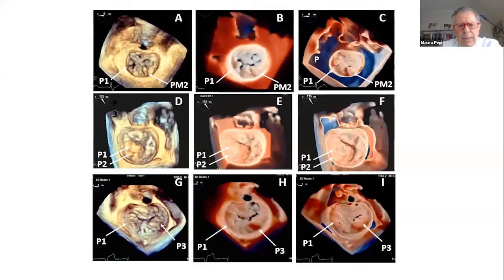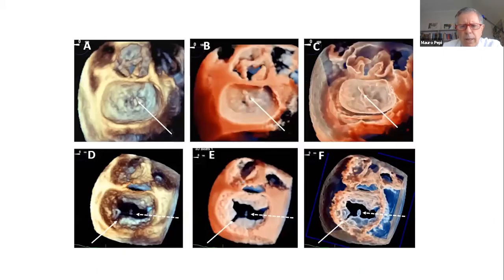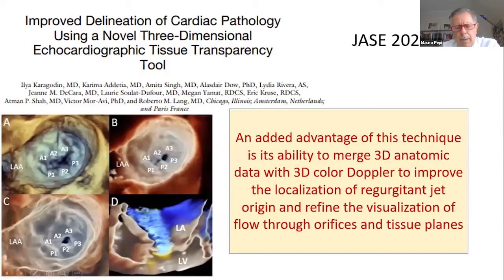We have several examples. I will go to the chordae. Please note, this method, transillumination, has also a sort of glass effect, and how easy it is to evaluate this small chorda at the level of P2.